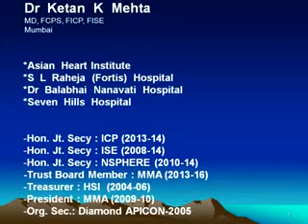Good morning. I think after Dr. Jayaprakash's speech on how to interpret an ECG in a rapid way, let us see what sometimes looks like abnormal, that is artifacts. These may be due to muscle tremors, hand movements, loose electrodes, cable problems, electromagnetic interference. So many things can mimic abnormalities, and sometimes junior doctors may mistake them for arrhythmias. And people have given shocks also in such conditions, thinking that it could be an atrial fibrillation or a VT. So let us just learn from Dr. Ketan Mehta what are all the artifacts which you can see and how to recognize them.